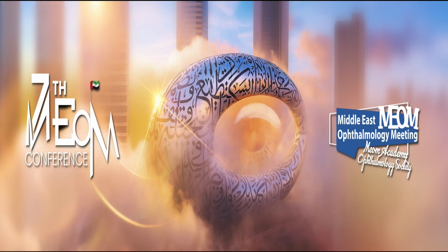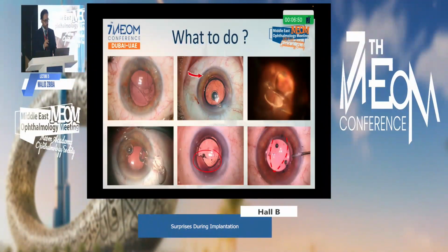We will talk now about surprises during implantation, several situations that we have to lead and to manage. First of all, when we face this situation, we have to stop and assess the situation. If you are lucky, you have someone, a teacher or coach at your side, or a friendly voice that directs you on what we can do.